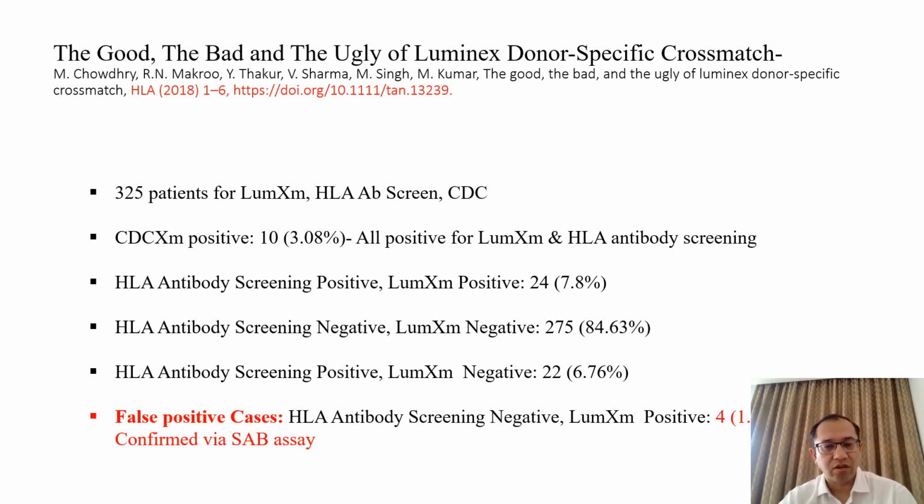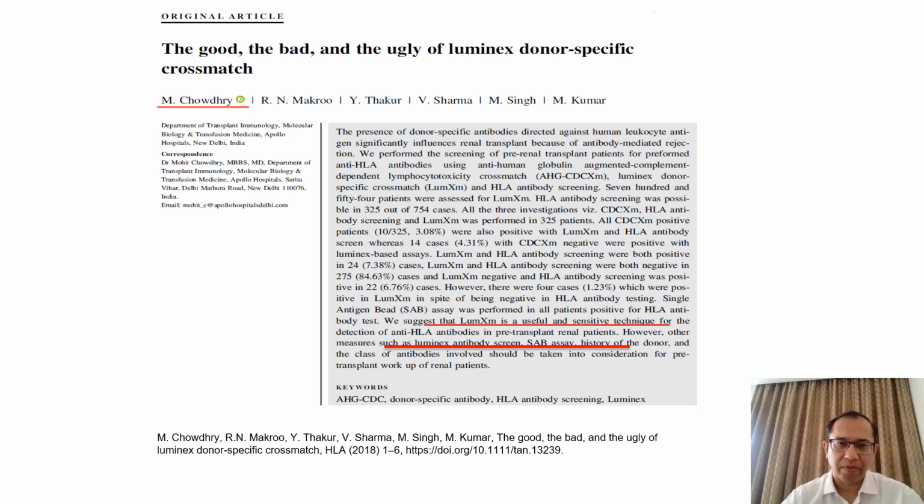But the part that I wanted to highlight is that there were 4 cases in which the antibody screen was negative, meaning there was no antibody, but still the Luminex crossmatch was coming positive, mostly with class 2 antibodies. This was confirmed by single antigen bead assay and we found that it was negative. So yes, this is the paper that we published.